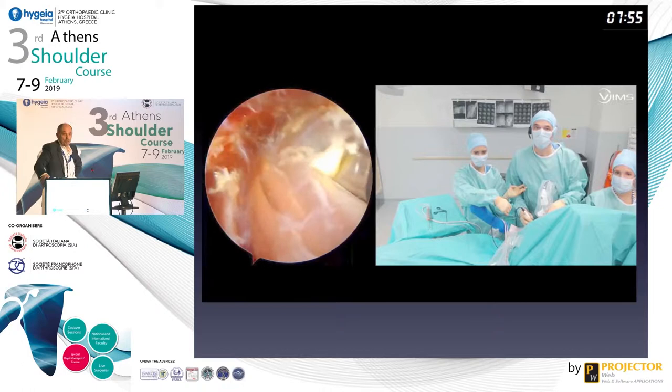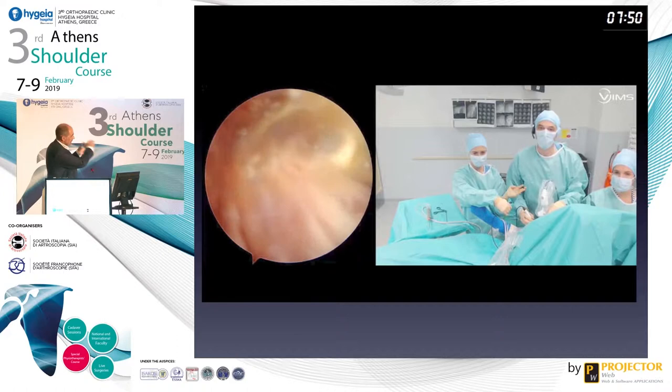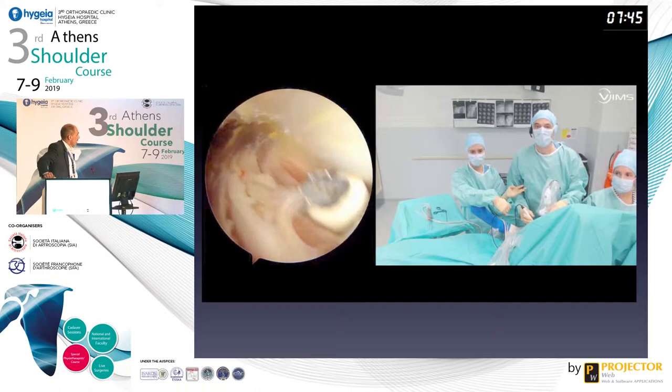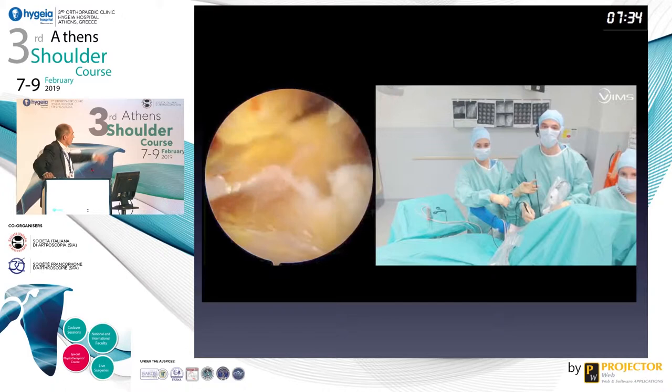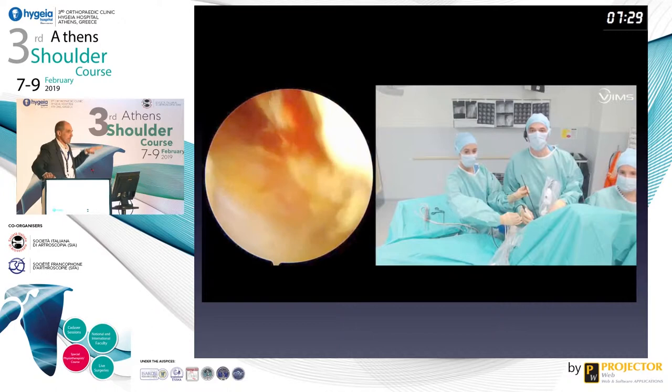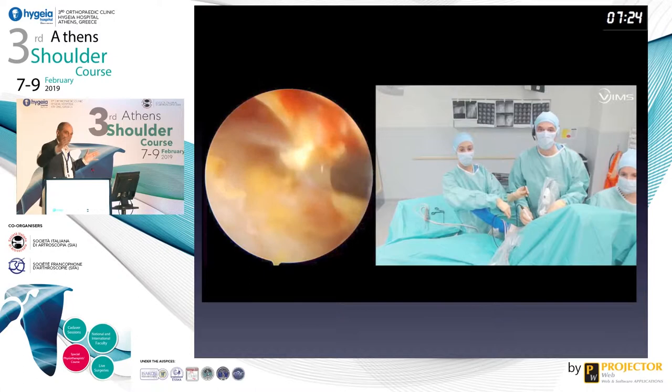So now I am trying to go at the distal part of the lat dorsi, inferior edge. I should say that it is the right shoulder. I'm sorry, I forgot to explain that it is the right shoulder. So now it is another hazardous point, because I am between the yellow, which is the radial nerve, and the white, which is my lat dorsi. I am at the superior and anterior surface of the lat dorsi. You have the radial nerve, which is oblique on the right, and you have to go over.